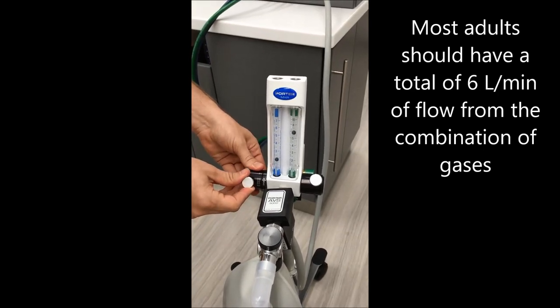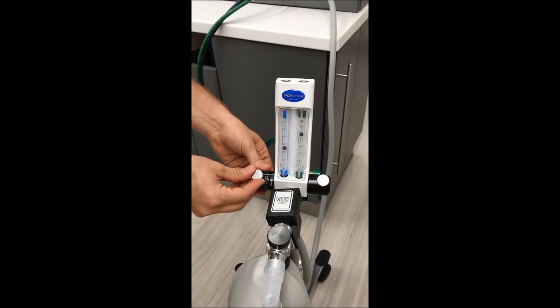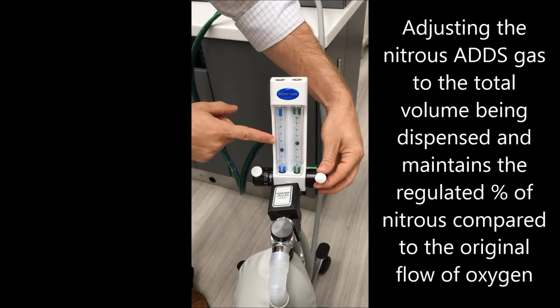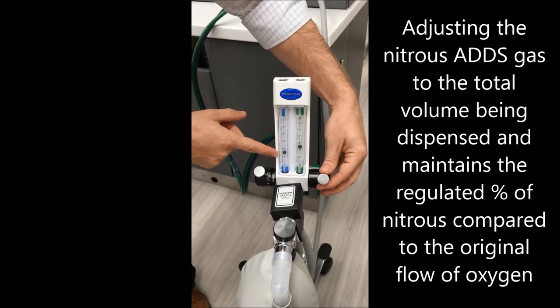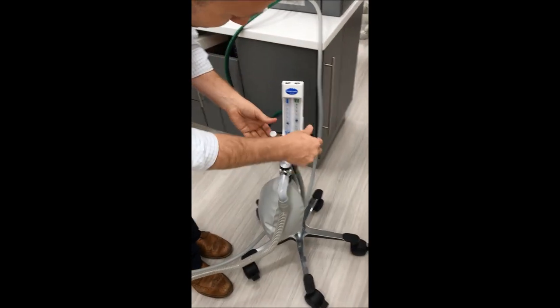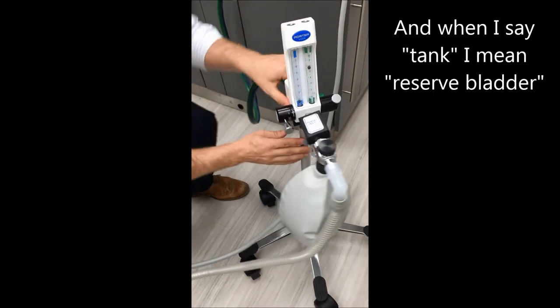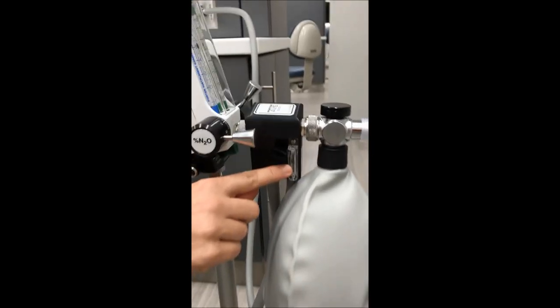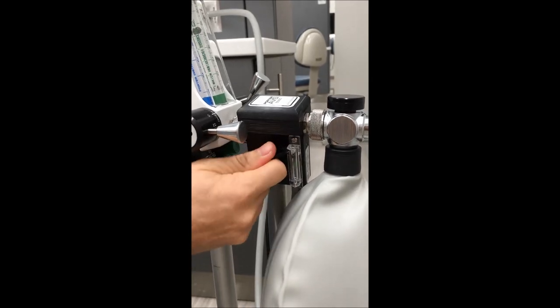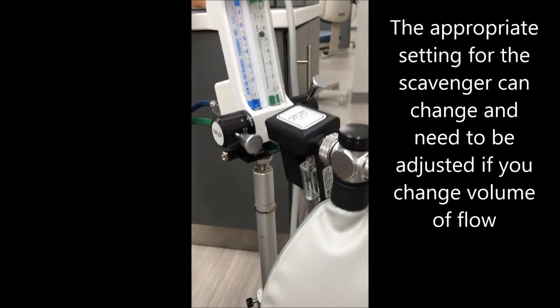Adjusting the nitrous side will change the percent of nitrous but will not change the flow. Once you decide on your percent — say we're at forty percent — the total flow would be at ten liters. We bring that down: say we want to be at about six liters total, so two and a half plus three and a half equals six liters. That way we're not wasting oxygen or nitrous. The tank is full right here. For the scavenger, make sure that little ball is in the green zone — not too high — so it's optimized for scavenging all the extra gas.